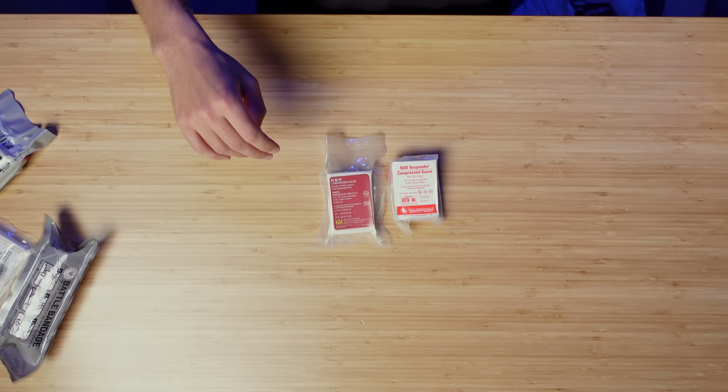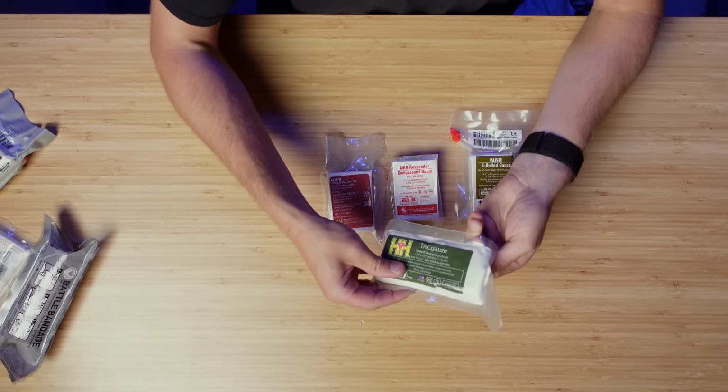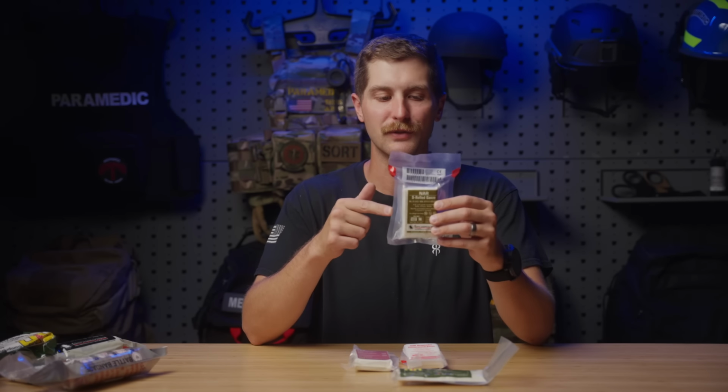We've got the NAR Responder compressed gauze, NAR S-rolled gauze, and then an H&H TACgauze here. I wanna start with this one because this really is the gauze that was the inspiration for this video because it can be very confusing. There's another version of this that comes in a green packaging. Don't be confused, they're pretty much the same thing.